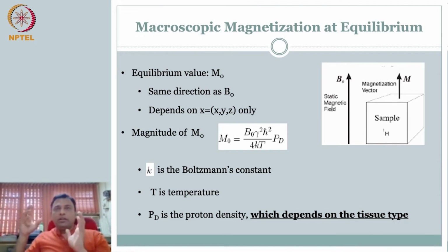We already spoke initially, right? We have to record this magnetization. If you have a magnetic vector that is looping, then I can actually put a coil and get a current that will be proportional to this. So we'll get to the details, but essentially this is the signal origin that we are talking about.